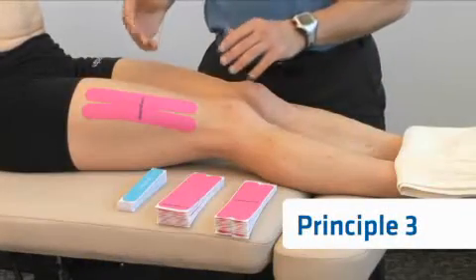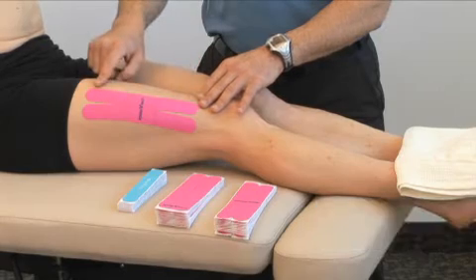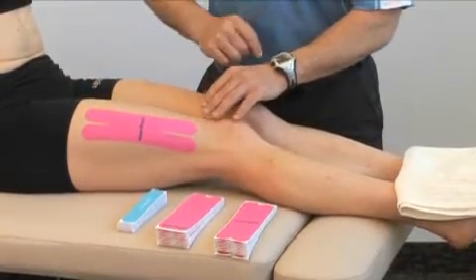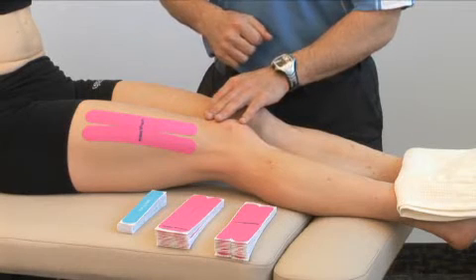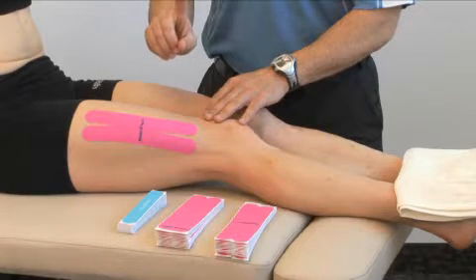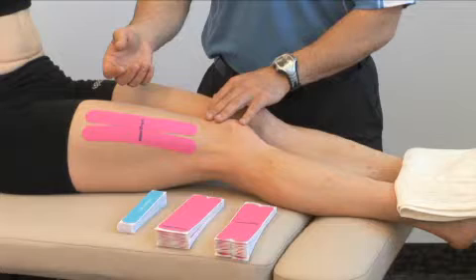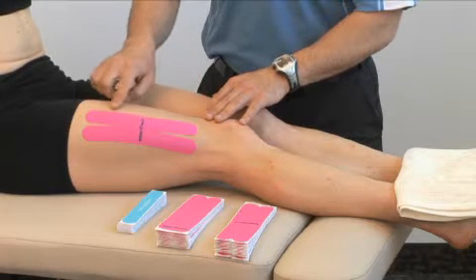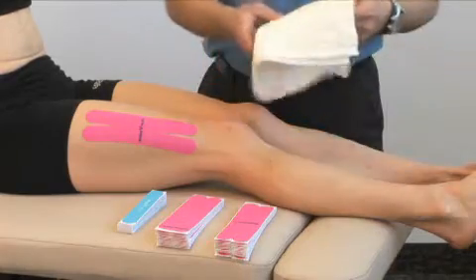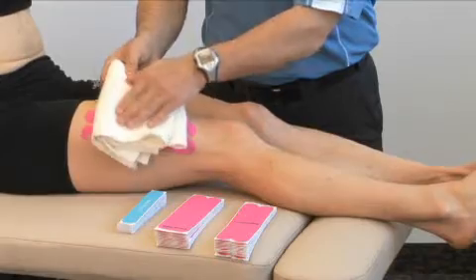For principle number three, once the tape is applied to the skin, it will remain on there for multiple days of continuous wear. We typically recommend about five days of continuous application. The tape should be applied approximately one hour before engaging in strenuous exercise or bathing. Once you have gone into a bathing situation where the tape gets wet, simply take a towel and pat it dry after you get out.